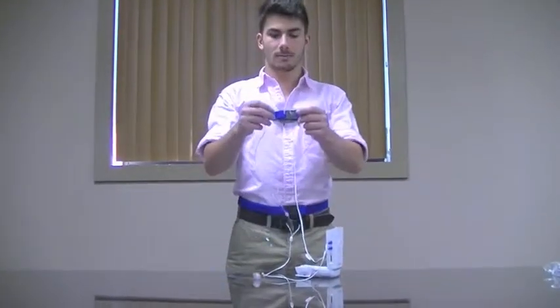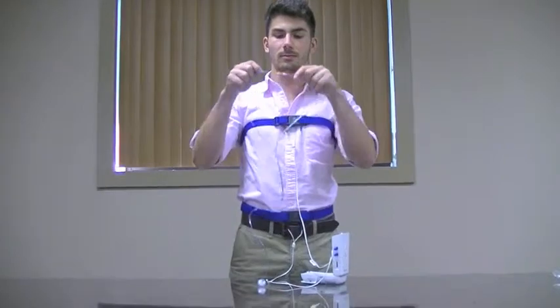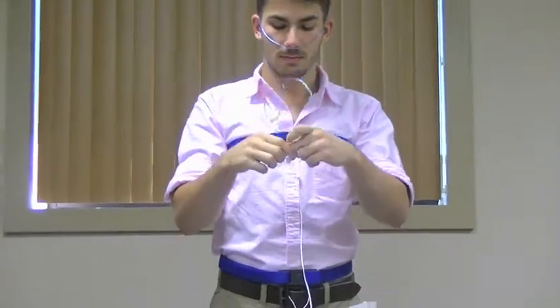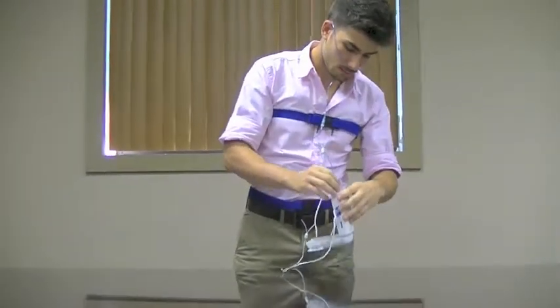Next, we will attach the nasal cannula. To do this, you will place the nasal cannula up your nose and position the wire up and around your ears. You will then screw on the wire to the top of the device as shown.